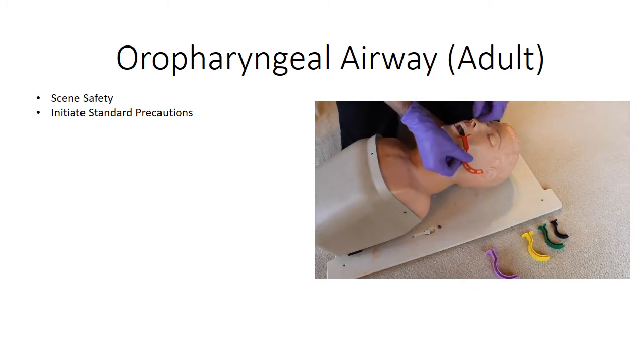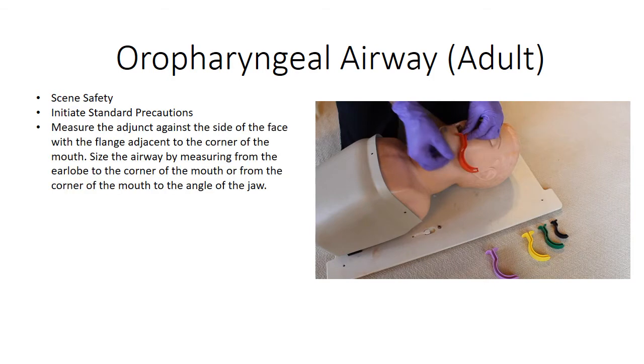Hold the adjunct against the side of the face with the flange adjacent to the corner of the patient's mouth. Size the airway by measuring from the patient's earlobe to the corner of the mouth, or from the corner of the mouth to the angle of the jaw.